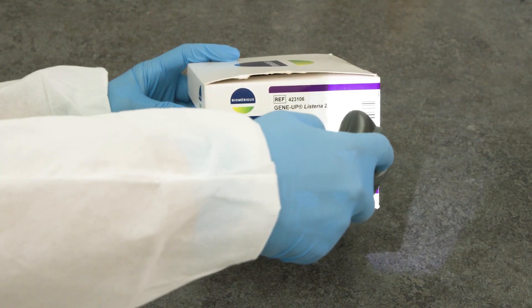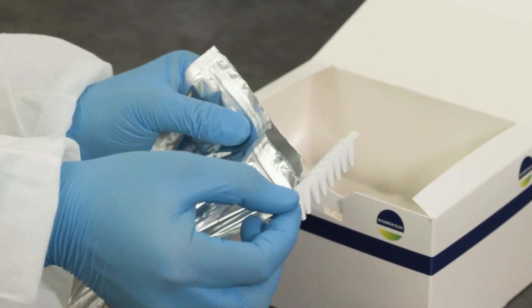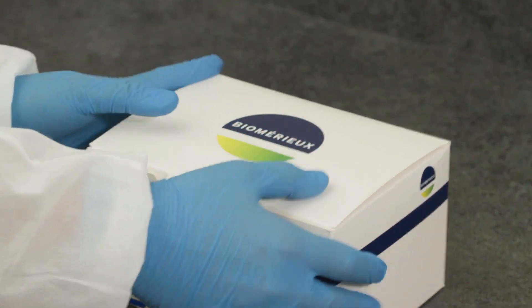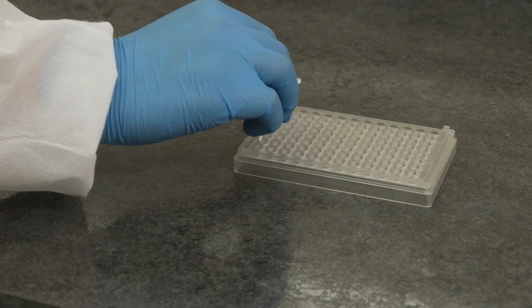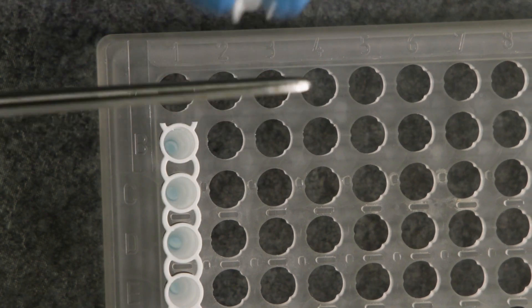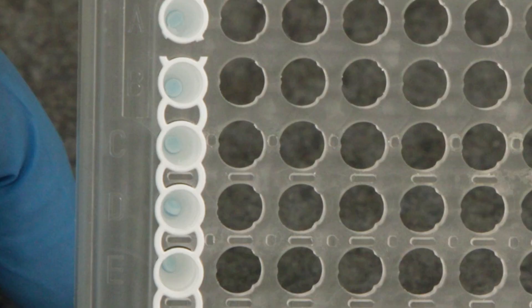Retrieve the assay kit and proceed with scanning the kit barcode into the GeneUp software. Aseptically remove the PCR tubes by pushing them out of the bag instead of reaching in and pulling them out. Seat them in the positions labeled on the plate map. Return unused PCR tubes to the foil pack with desiccant and return them to their storage area. The content of the pouch is stable for two months after opening if correctly sealed and stored. Take the sealed strips and gently tap the bottom of each one on the counter to ensure that the freeze-dried pellet is seated at the bottom of the tube. Wearing new powder-free latex or nitrile gloves, carefully open the caps to prevent spilling the freeze-dried pellet. If a pellet is lost, cut to remove the tube and replace with a new one. Visually check for the presence of the freeze-dried pellets at the bottom of each tube; the pellets, if present, will be a light blue color. Replace any affected tubes.